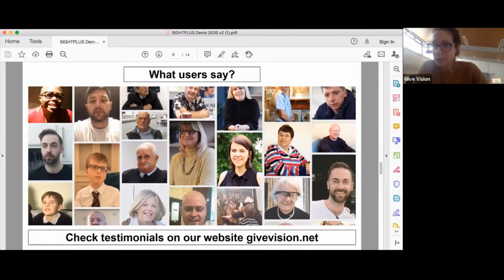So we started working on that with Michael's support and also other SightPlus users. And we are now looking for new testers. What we have now is just a normal eye test, the one that you would normally do at the optician with the letters, where you say which letter you can see. So it's very similar to that, except that it's happening on the screen. And with the remote control, you give your answers.